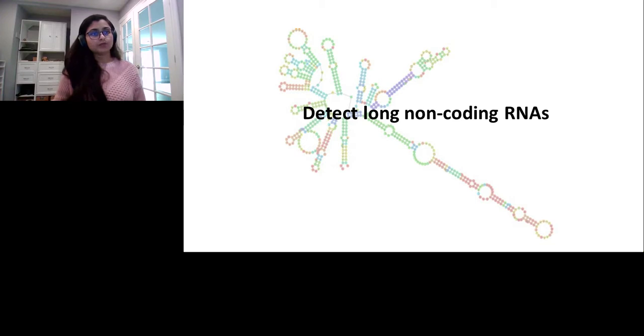In this second example, these researchers wanted to study the expression of this long non-coding RNA in breast cancer brain metastasis. As you can see here, they compared the expression of this long non-coding RNA between breast cancer that had brain metastasis compared to breast cancer that was negative for brain metastasis. And the expression of this long non-coding RNA is significantly upregulated in the sample that had the brain metastasis, indicating that this particular long non-coding RNA is a prognostic marker for indicating progression to brain metastasis.